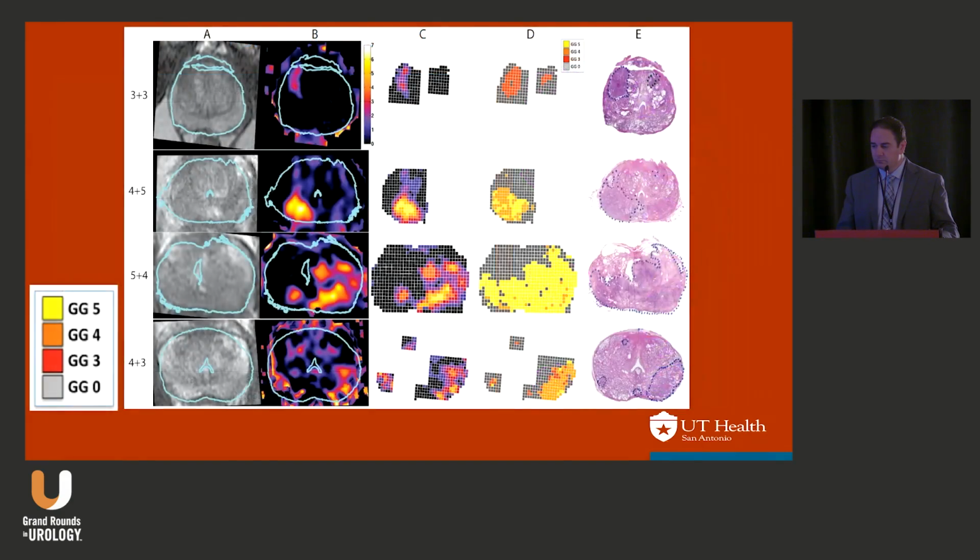Then we took, and God bless the pathologists again, we have some great people doing this work, a voxel by voxel approach. Can we see the images on MRI, line them up with the pathology images, and make sure these are truly higher grade, and what that color pattern looks like? What does that heat map look like? We've shown a pretty accurate description of this through this paper.